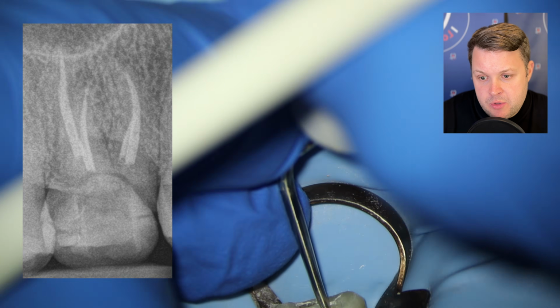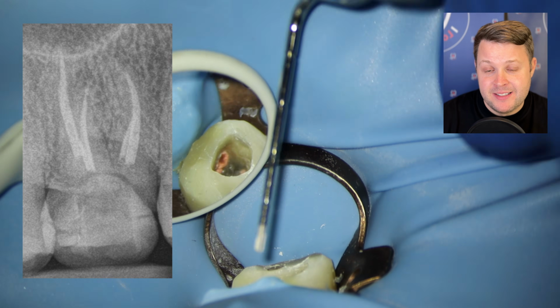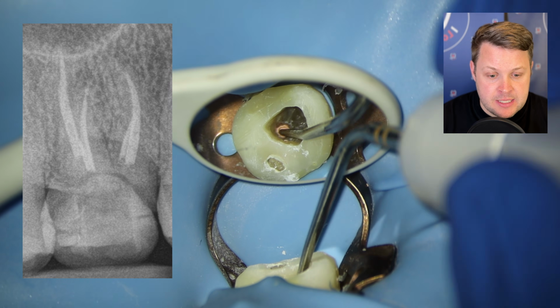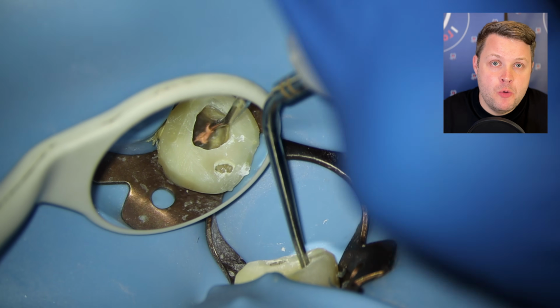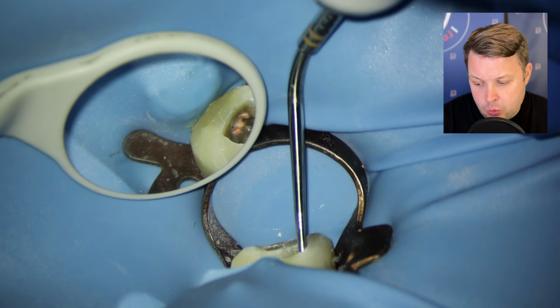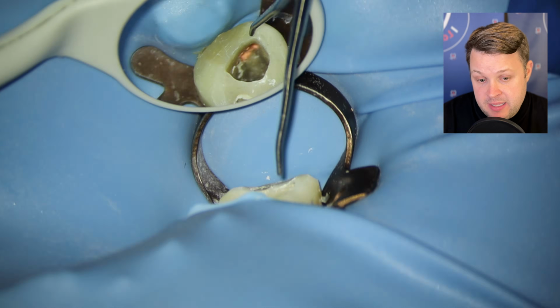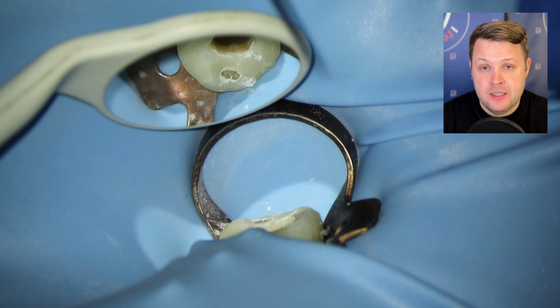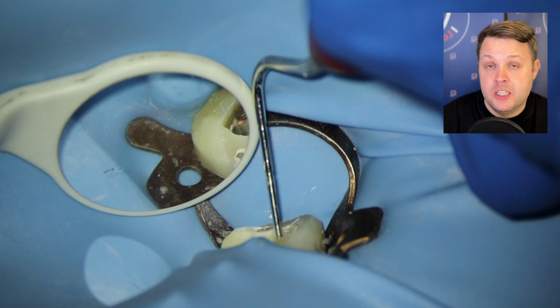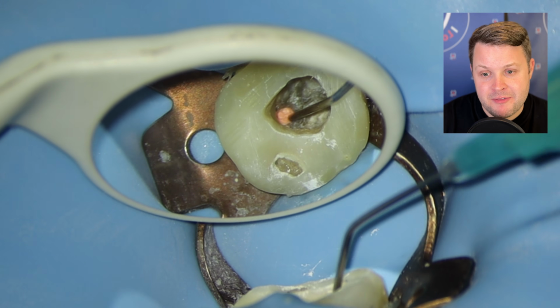I suppose there's an argument to say there's a lot going against this tooth. This tooth's a re-root treatment. It's got a questionable prognosis, and also we couldn't seemingly get patency on one of these canals. But overall, we've had an open conversation with the patient, haven't we? We've told the patient all the warts and all problems with the tooth, and they've made the decision to try and save the tooth. And in the end, if it's an acceptable tooth to save, then I'm happy to have a go. And then we're finally ready to temporize the final tooth.